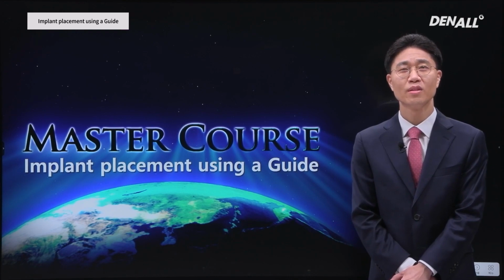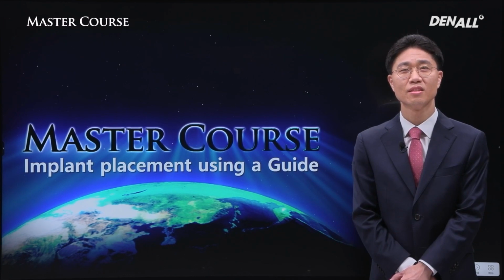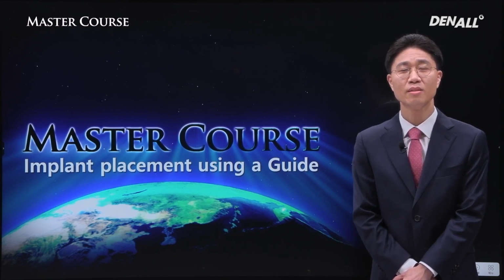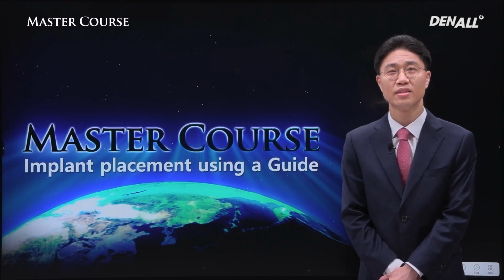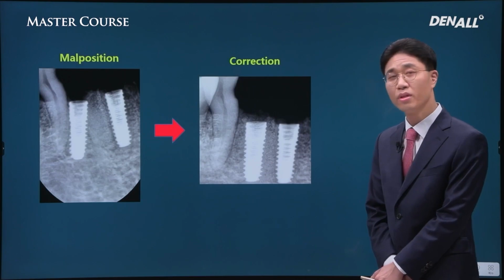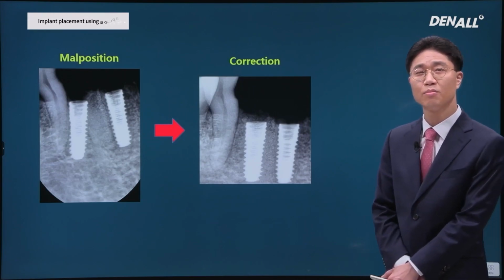Prior to the offline Master Course, albeit in a short time, I'm going to address a part of the Master Course with you today. Today, I'm going to talk about implant placement using guides. I'm going to talk about the basics of the said contents. Let's take a look. Let me show you a clinical case first.